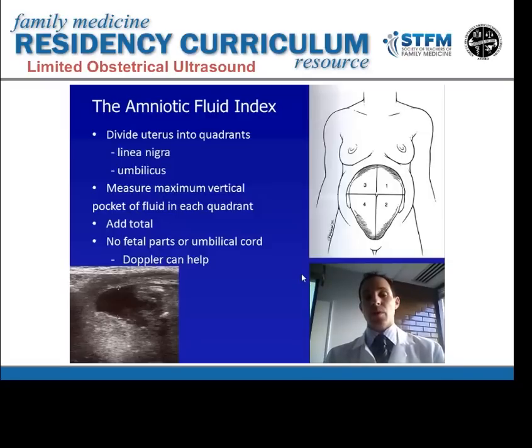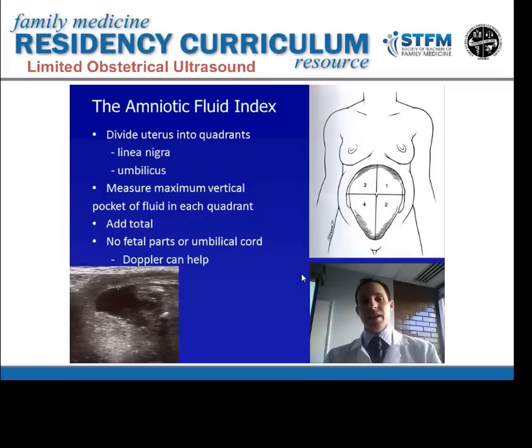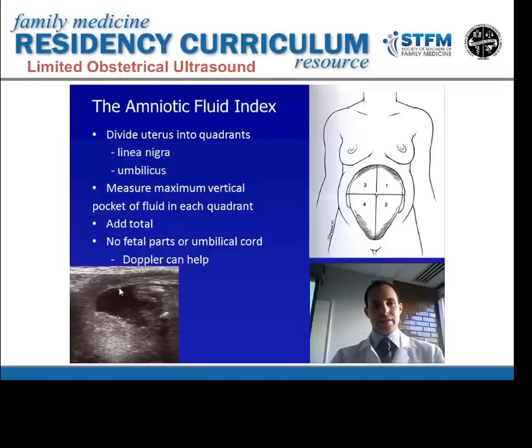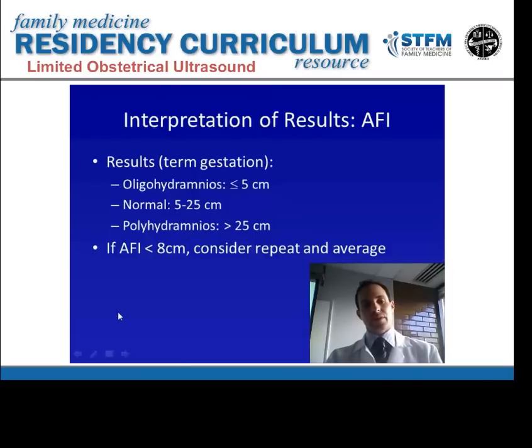You measure the deepest pocket of fluid without any fetal parts or umbilical cord, and add up the total from all four quadrants. On the bottom left you can see a good example — a typical view of what you might see in quadrant three. The calipers are measuring from the anterior to the posterior part of the uterus, with the fundus above, a posterior placenta below, and fetal parts to the side — giving a nice pocket of fluid to measure.